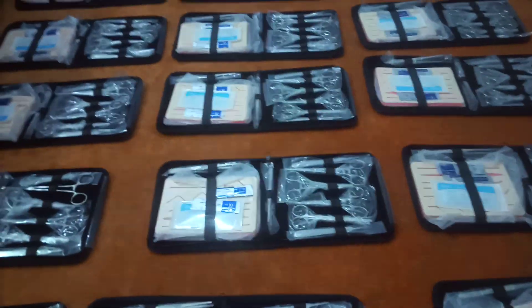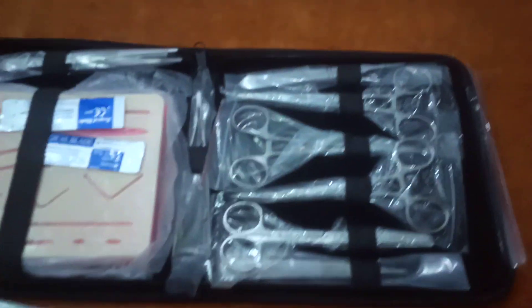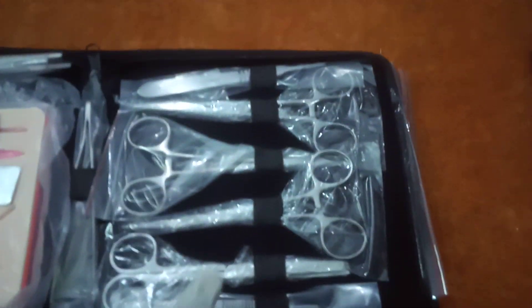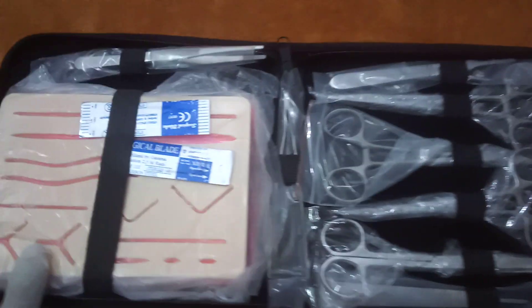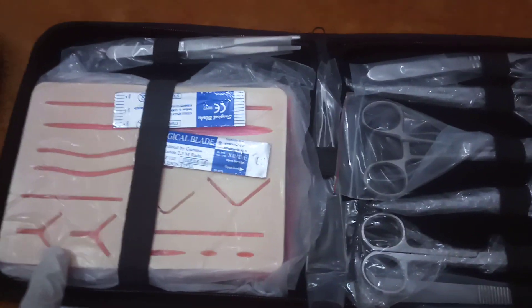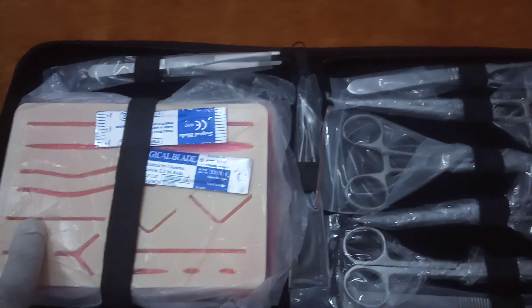Hello to all my viewers. This is a section instrument set — this shipment is getting ready, so I'm going to show you a little review of it. Here we have multiple equipment, including sculptor handles, needle holder, and a silicone pad as well, with deep layers of multiple things.